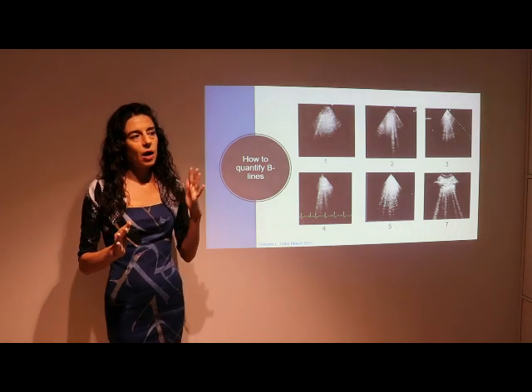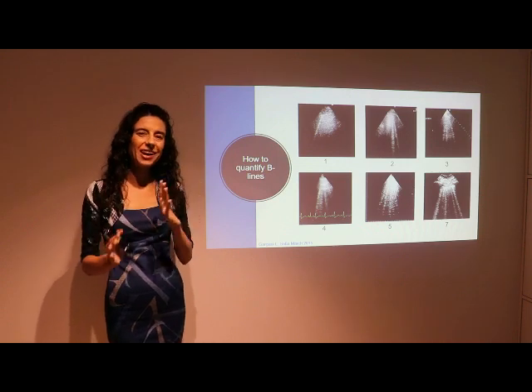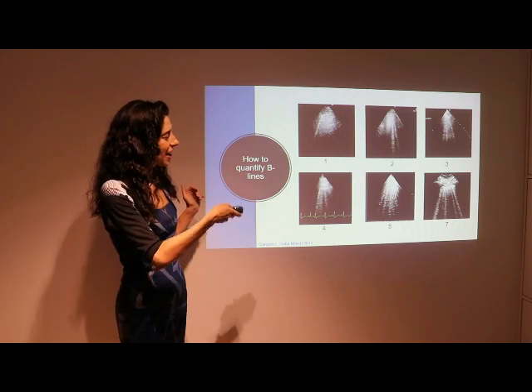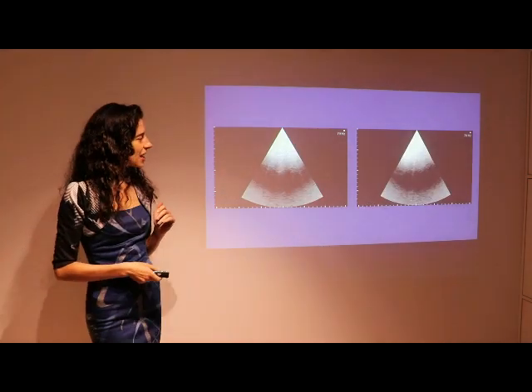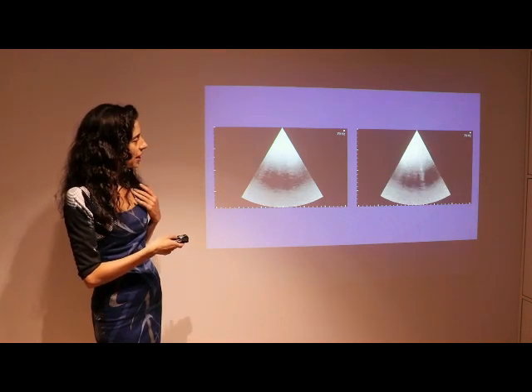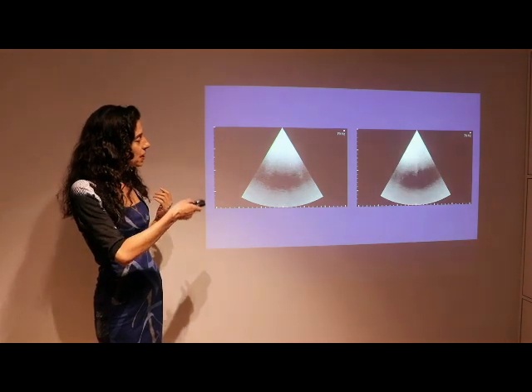When you have a zebra-like pattern, half and half, black and white spaces, like here, then you have 5 B lines. And here is an example. I hope it will get moving. Yes, you see how the B lines appear.